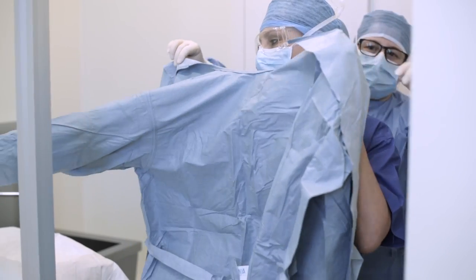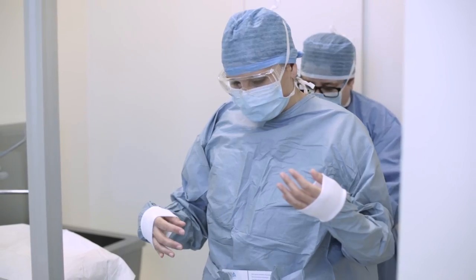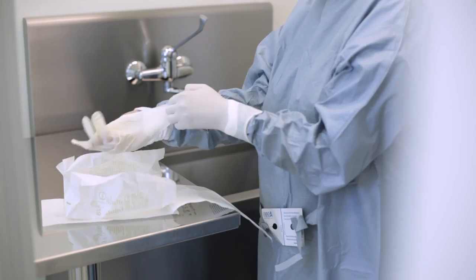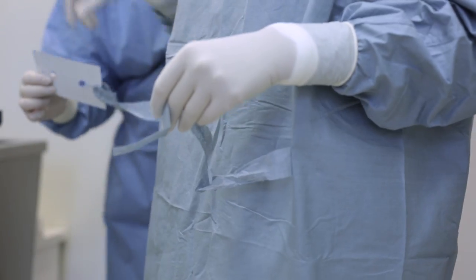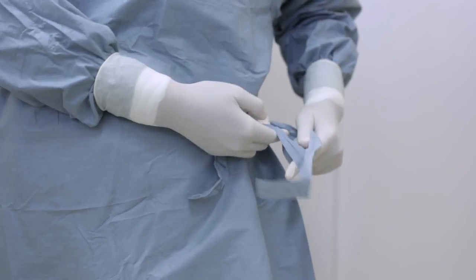After surgical washing, the operator wears the surgical gown, helped by the non-sterile assistant. The gown has a surgical folding so it can be worn avoiding accidental contamination, and it has a special cardboard to help tie its laces. All operators must wear goggles, breathable cap and mask.